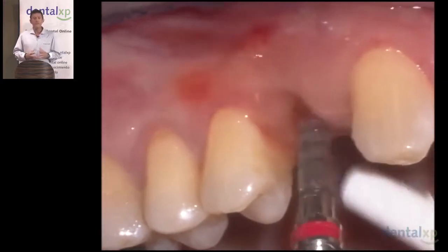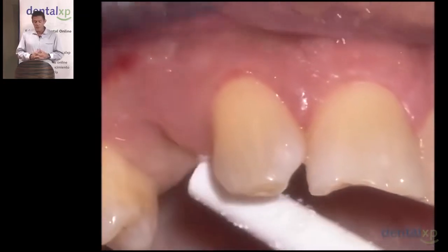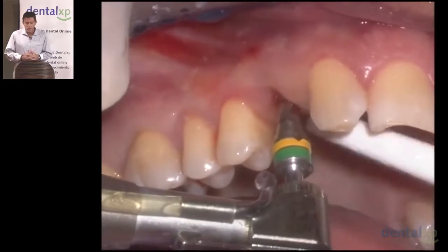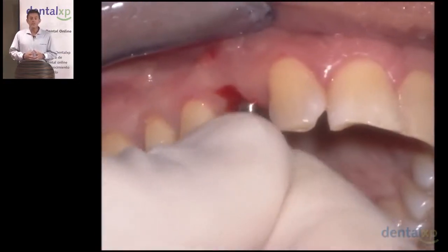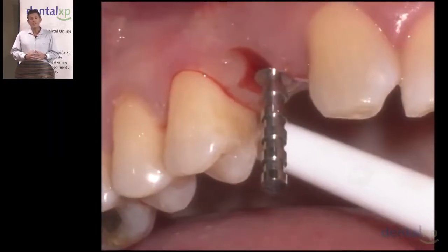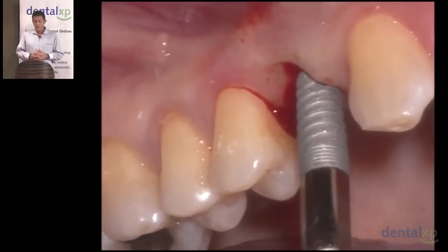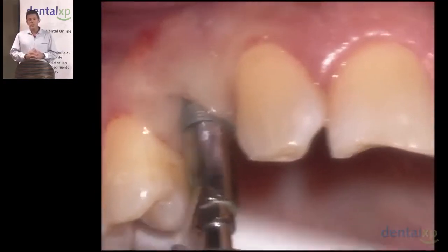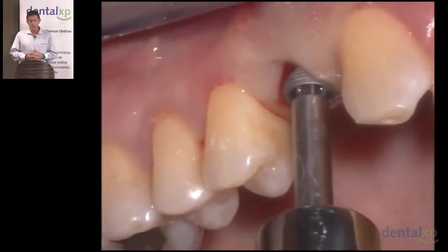And this is sort of reverse engineering. What you're going to see today is allowing the area to heal first and then coming back and placing the implant. We're utilizing the Ritter Dental implant system. We're drilling through the soft tissue transmucosally, understanding that we have the proper angulation and enough bone to support the implant in this area. As you can see here, the implant is then placed utilizing a hand driver, and we're going to gain 40 Newton centimeters plus of initial insertion torque.